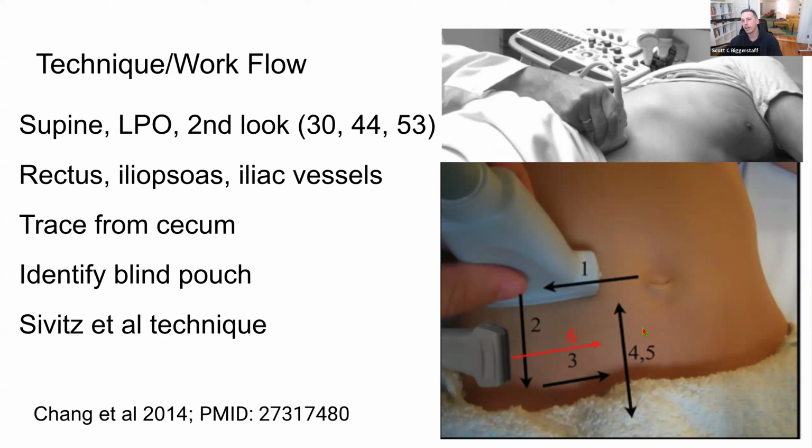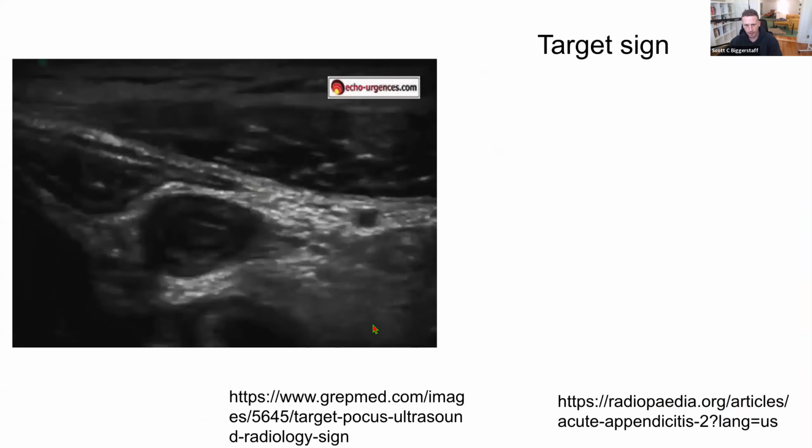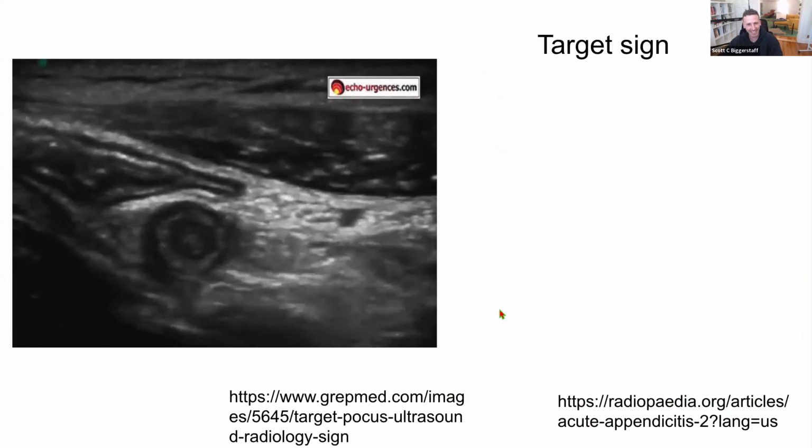A lot of the abdominal ultrasound stuff, they advocate for a lawnmower approach. You see the lawnmower in there a lot. A lot of people are mowing their lawns, it seems. So that's sort of the best way we have to describe this. But you're just trying to cover all your bases and identify relevant anatomy in each area so that you can hone in on the structures of interest. So that was a lot to say.